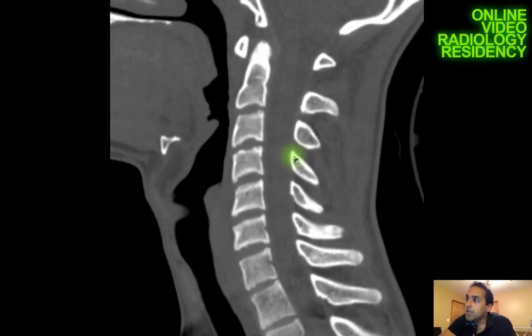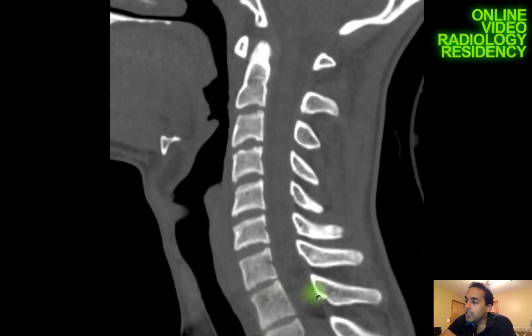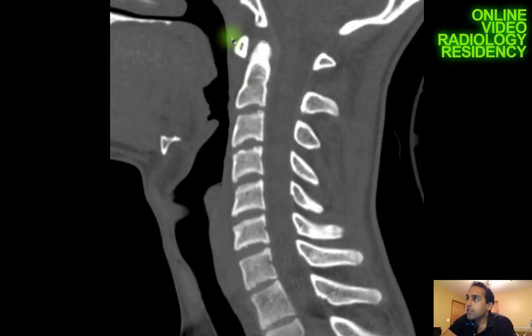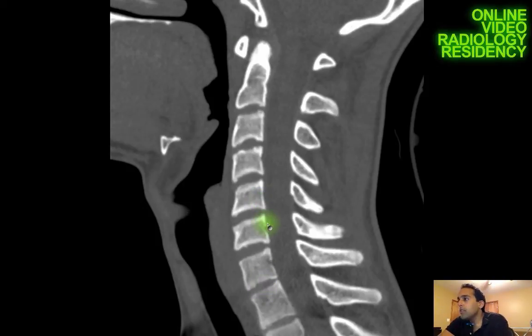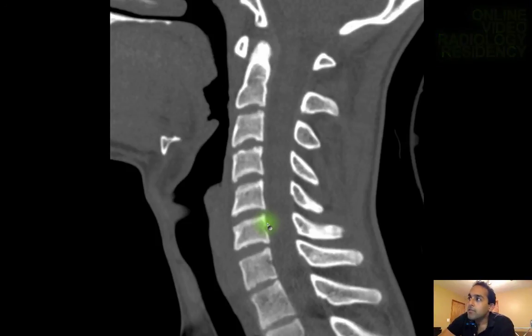Now I'm ready to dictate. For the impression, I like to say there is no acute fracture or traumatic subluxation — meaning no slip of the vertebral body on another due to fracture of the vertebral body or posterior elements. I also add that there is no pre-vertebral soft tissue swelling and no epidural hematoma. That's basically my search pattern for a non-contrast CT of the cervical spine.